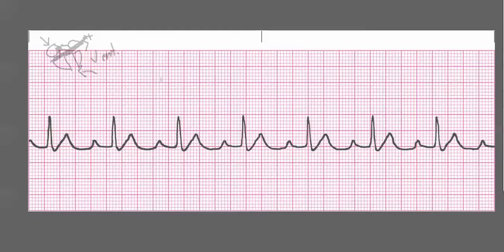Looking at this particular ECG, when we ask what the rate is — one, two, three, four, five, six, seven — the rate is 70. You do have P waves, the QRS is narrow, and a T wave after it. That's the same across the board, so the rhythm is regular and you have P waves.